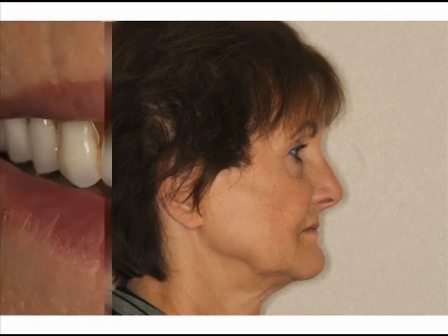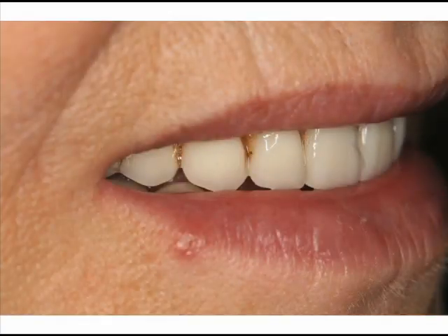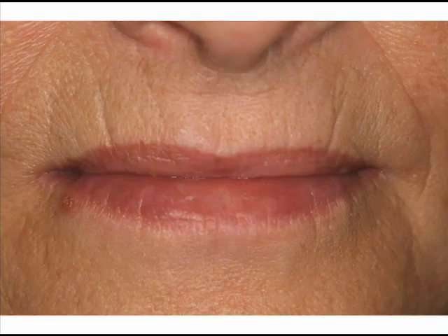Our first slides today demonstrate the facial and lateral views of a 64-year-old white female who has been edentulous for more than 25 years. Figure 4 demonstrates her conventional maxillary complete denture, and it was certainly retentive and provided enough lip support for proper aesthetics, but her conventional mandibular complete denture was never completely stable and dramatically diminished her perceived quality of life. It just moved around and was a real problem.